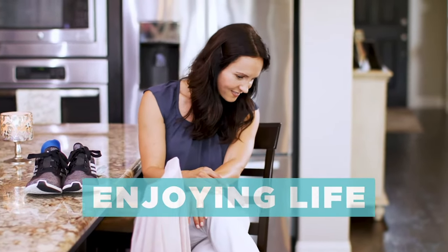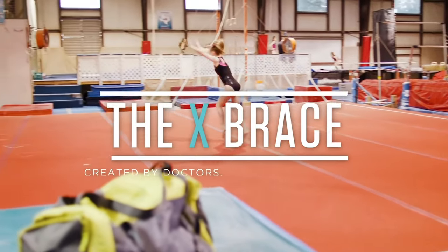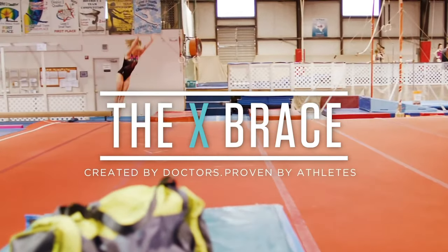The X-Brace will have you back enjoying the life you love without the foot pain that has been holding you back. The X-Brace, created by doctors, proven by athletes.